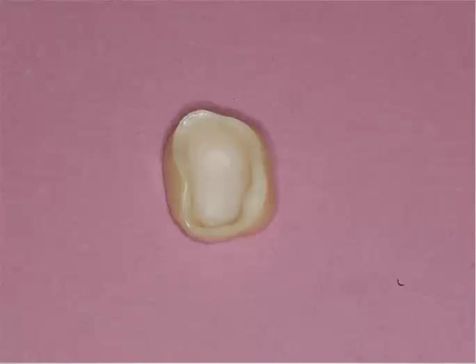In this case now, we get our crown back from the lab. This happens to be a Lava crown. There are many different crowns on the market, Bruxir, Procera, but this is a zirconium oxide-based system. It's a polycrystalline mineral oxide. It's got a flexural strength of 1,200 megapascals. Extremely hard, very dense material, very wear compatible, fracture resistant. These systems come with warranties as well.